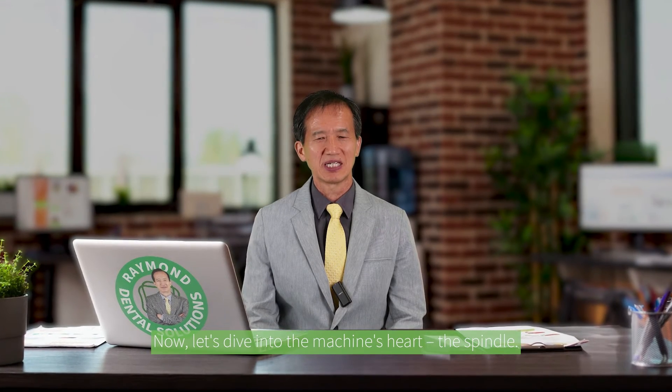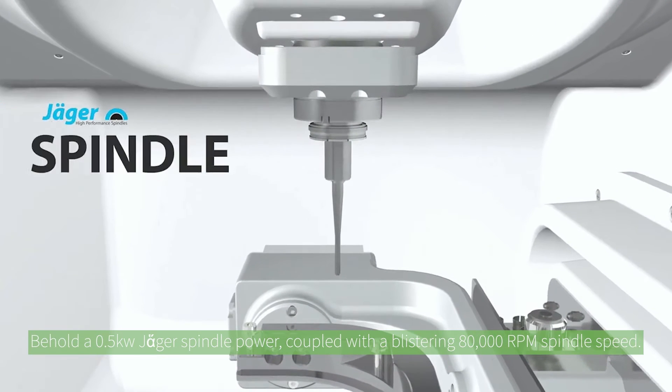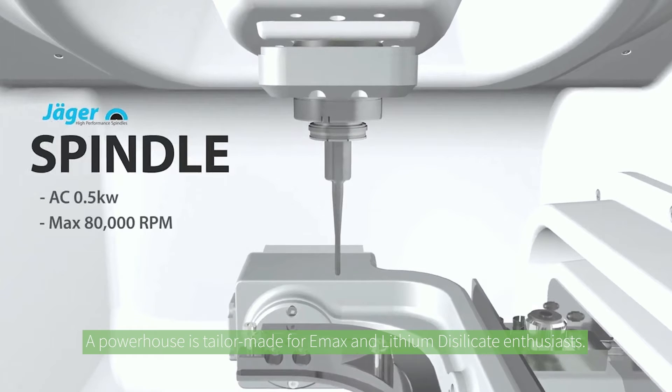Now let's dive into the machine's heart: the spindle. Behold a 0.5 kilowatt Jäger spindle power, coupled with a blistering 80,000 RPM spindle speed — a powerhouse tailor-made for e.max and lithium disilicate enthusiasts.